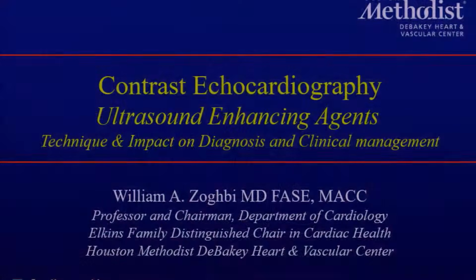It is unique for ultrasound because these ultrasound enhancing agents, or even saline agitation, interact with the ultrasound beam. So it depends on your settings. If the settings are not optimal, you're not going to see the best images.